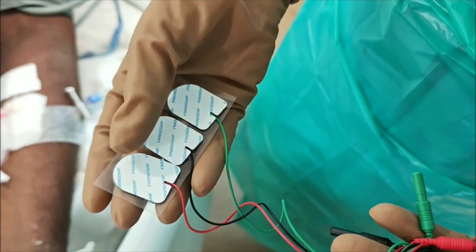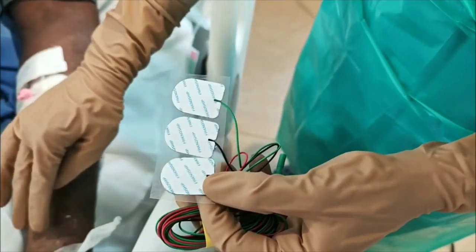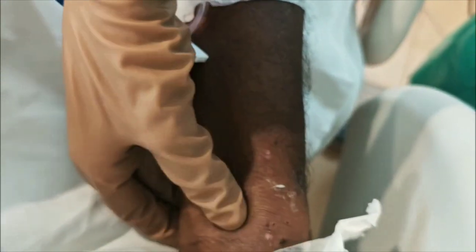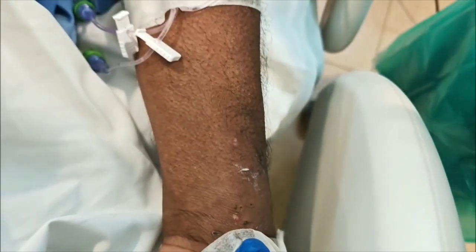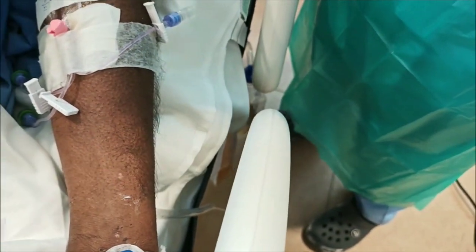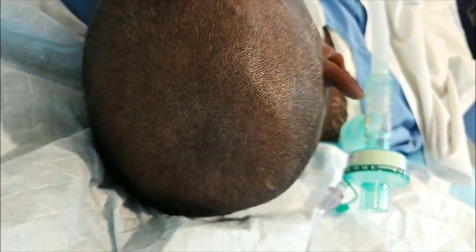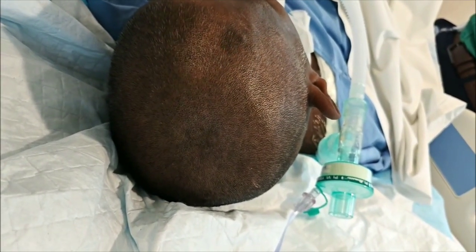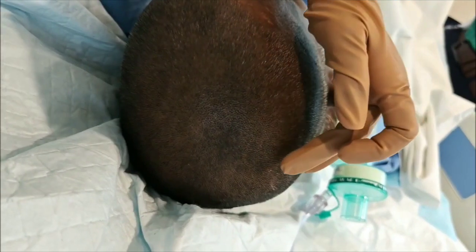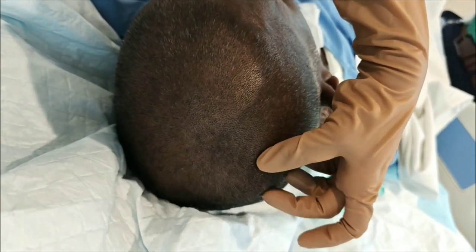These are the patch electrodes — they have an active, a reference, and a ground. The active and reference will be connected between the two tendons: palmaris longus and flexor carpi radialis. The recording electrodes will be connected on the contralateral primary sensory cortex, area 3-1-2. Based on the international EEG placement system, we place it on the contralateral side at C3-prime, which is two centimeters posterior to the actual C3 placement.